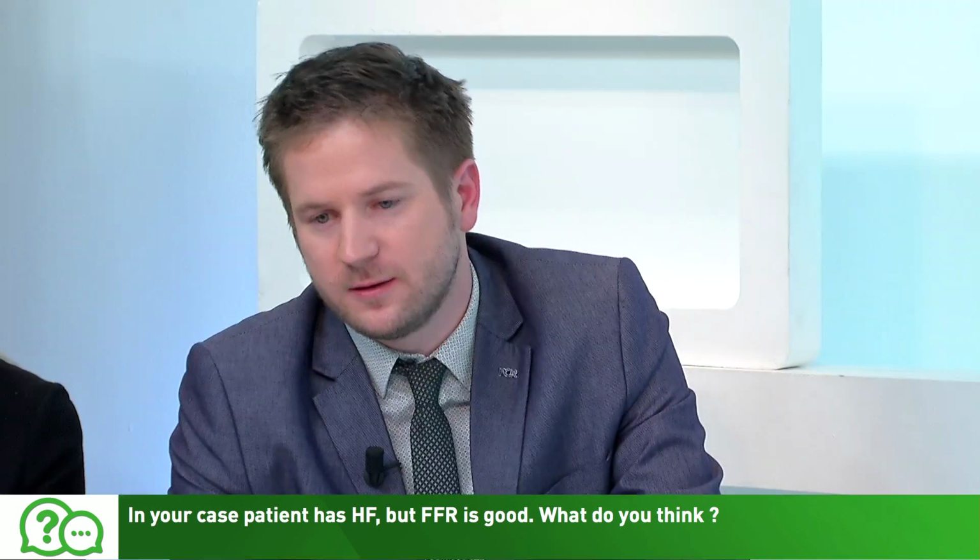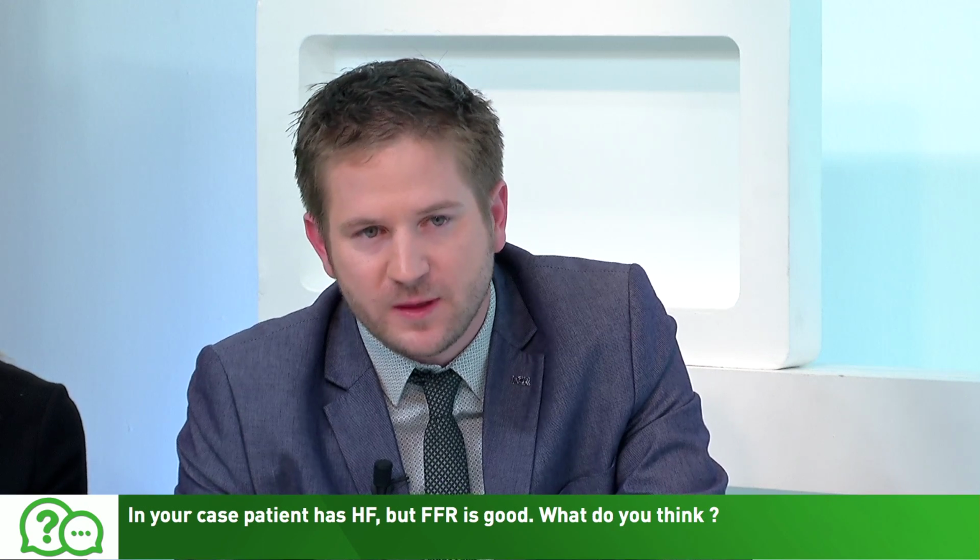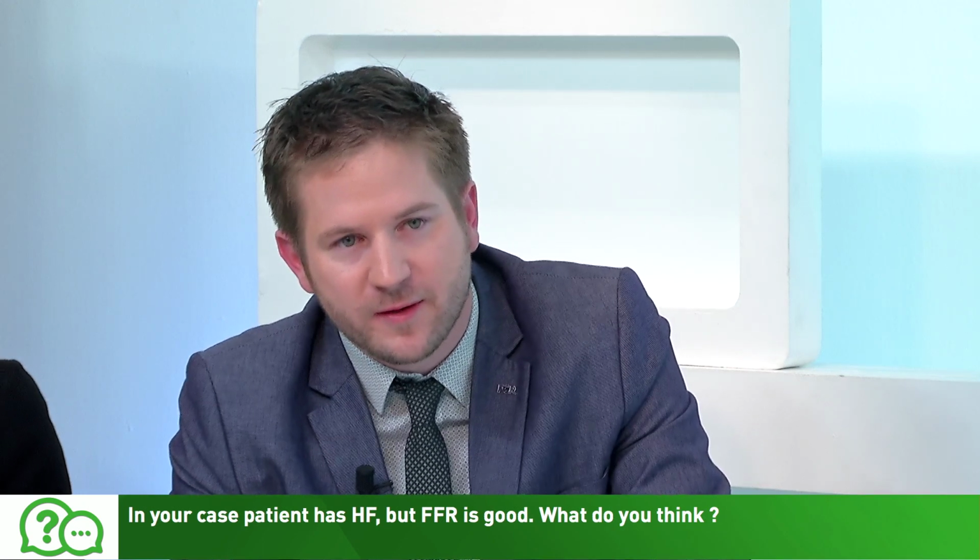Well, what we know, we have, again, good data to support that increased right atrial pressure or central venous pressure does not have any clinically relevant impact on the reliability of the measurement. So if we translate this question in this way, whether in a patient with an increased central venous pressure due to heart failure, whether we should change our cutoff or not rely on FFR, then I can say that we have good data supporting that FFR is reliable also in these clinical settings.